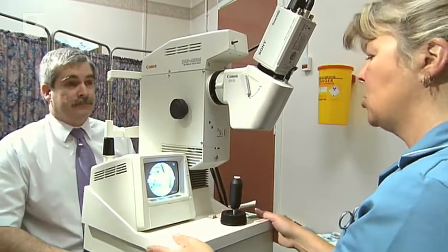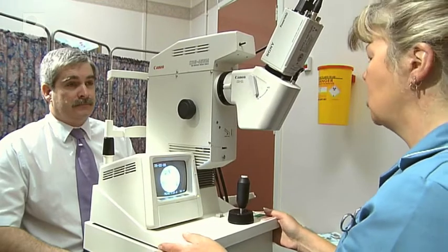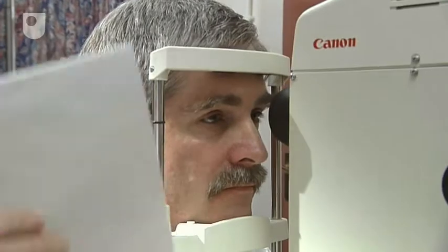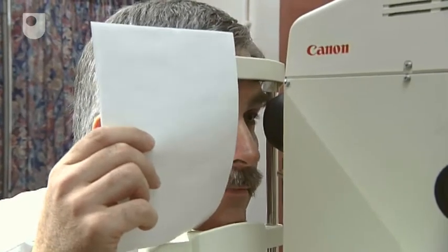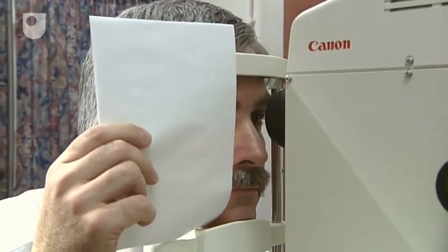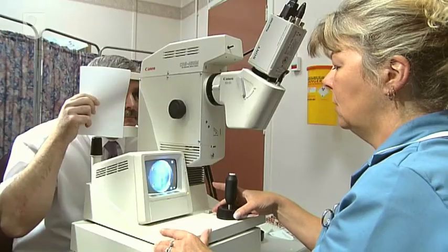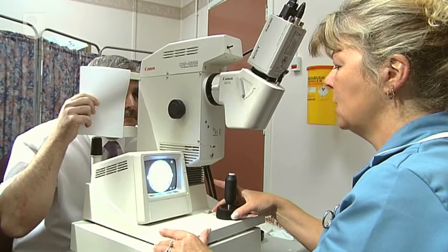When you're ready, if you pop your chin back on the rest and we'll do the other eye. If you could put the paper over the other eye. Okay, that's it. Cover that eye.